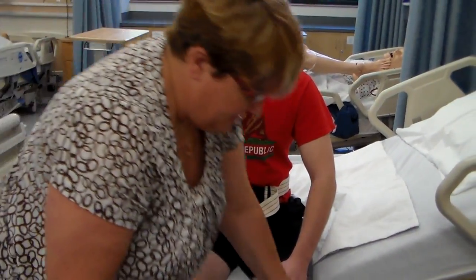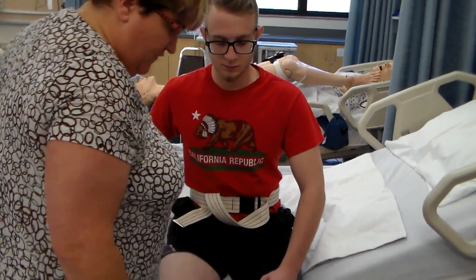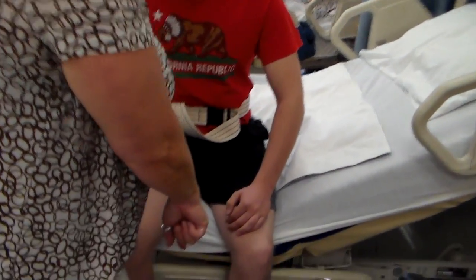The other thing is that you want to be able to get your feet by your patient's feet. And what you do is you put your feet right in front of them. That way their feet aren't sliding. See, if I was to stand him, his foot could actually just slide like this right across the floor. Even with non-skid slippers on, they can still slide. If I put my foot in front of his, just like this, okay?